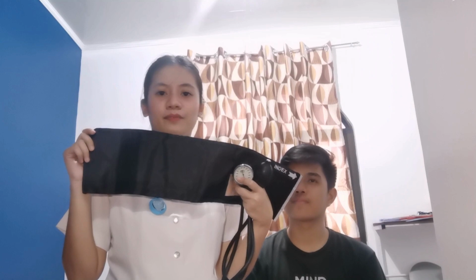So the ninth step is to determine the BP device and what cuff size is the most appropriate for the patient. Appropriate size of cuff must be used to ensure an accurate measurement. If the cuff size is too small, the reading may be falsely high and it may come loose as the cuff is inflated. If the cuff is too large, the reading may be falsely low. So I will be using an adult cuff size.